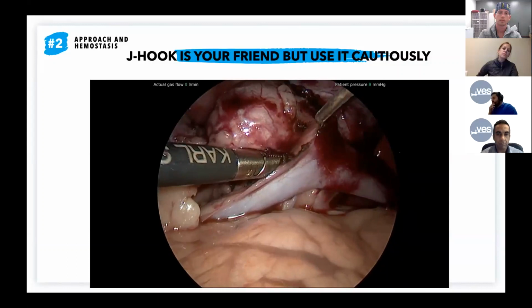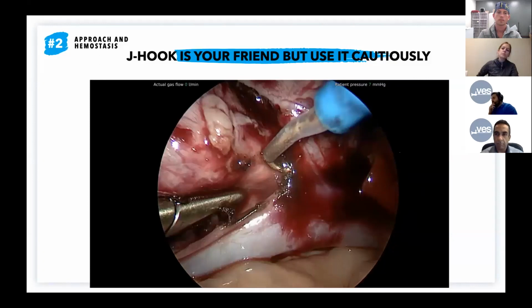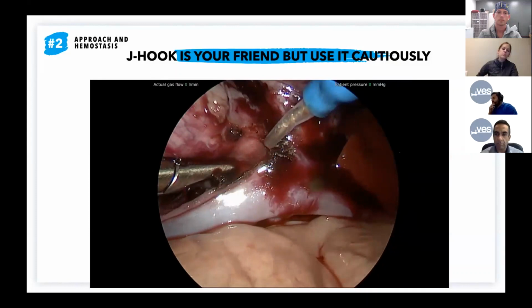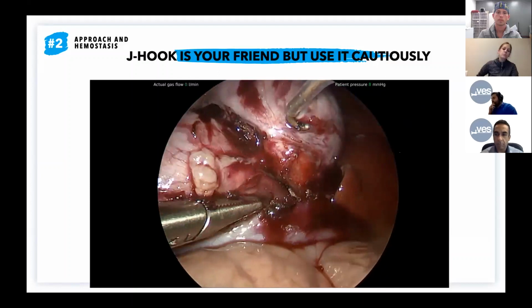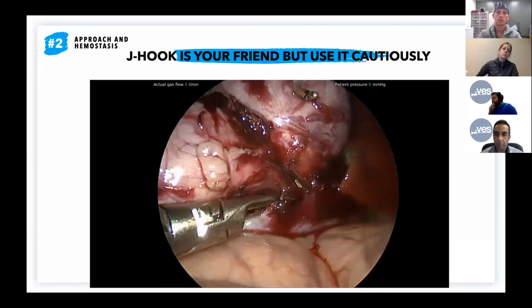Now, again, there's lateral thermal spread with these, there's peripheral energy dispersion. So you want to be away from those. You don't want to be coming through large vessels. Obviously, monopolar is not going to be suitable for just coming through a substantial phrenico-abdominal vein, for instance. But I find it great for these little fine planes. And I will often pick away at those planes to try and find my plane between my cava and my adrenal mass, especially on the right-hand side.